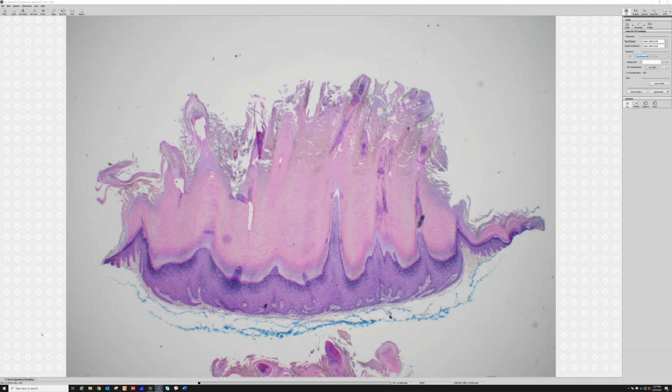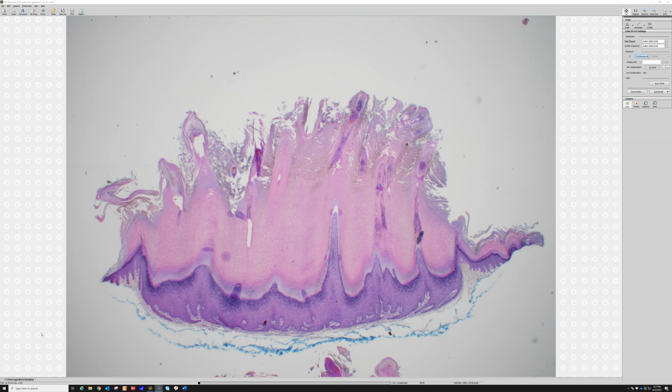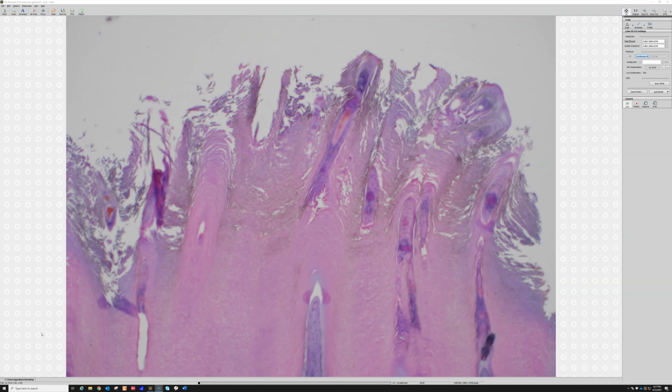And also look how thick the corneal layer is. Sometimes the corneal layer can get really, really thick, particularly on warts on acral skin. And so there'll be times where a good dermatologist has done a nice thick shave and they thought that they've gotten me enough to get the wart. And all I'll see is the corneal layer with some spires of parakeratosis. It'll look basically like, imagine this was the whole biopsy.